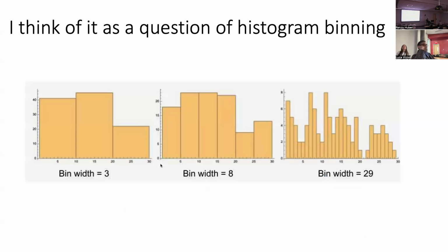There are some similarities here with respect to histogram binning. If you have data like that, where you have a separate sample over here, but it's also noisy, you need to choose the right binning. If you only have 3 bins, you might miss that this is separated here, but then also you want to average enough neighboring voxels that meet your SNR requirements.